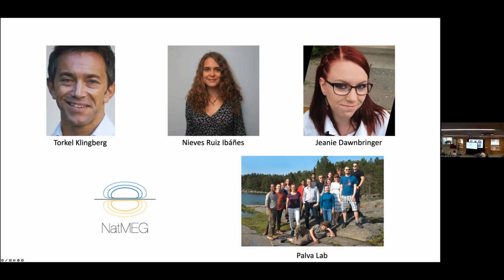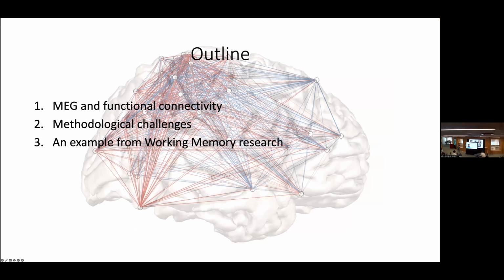Okay, so to start, what is MEG? Even if you don't know what MEG is, you probably know what EEG is. So you get this very fancy cap that I have on here, and you put electrodes and then you measure the electric current or the electric field generated by the neurons. We get really good temporal resolution from EEG. A problem though is spatial resolution.